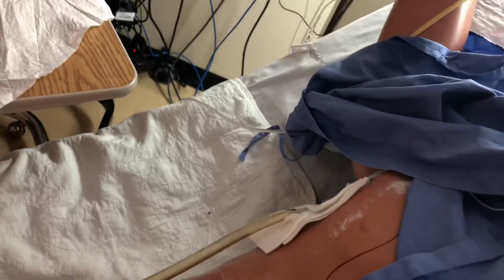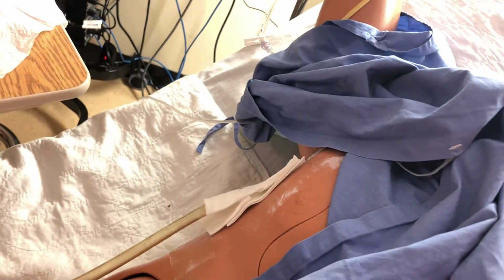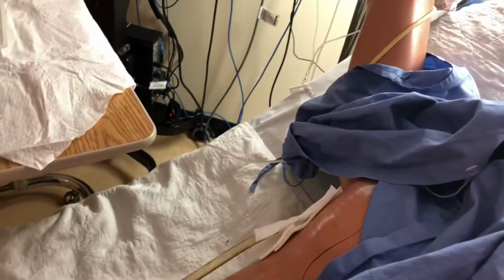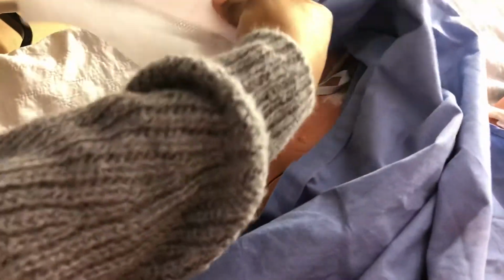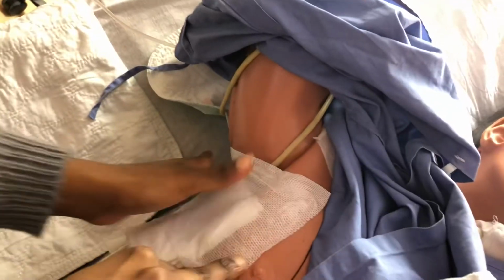So now I'm going to put my 4x4 just on top. And then now I would cover with my... make sure it's sterile. I'm using Mefix tape. Okay, so ensure not to stretch so I don't have to pull this. Go once. Ensure it is fully occlusive, there is no air in it. Take this off. Go up. Okay.